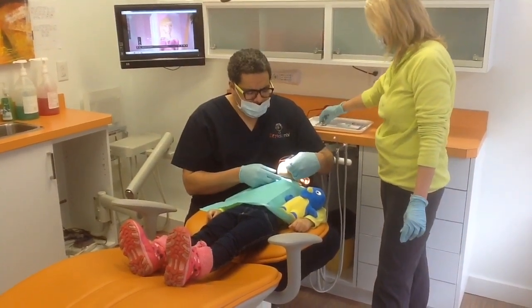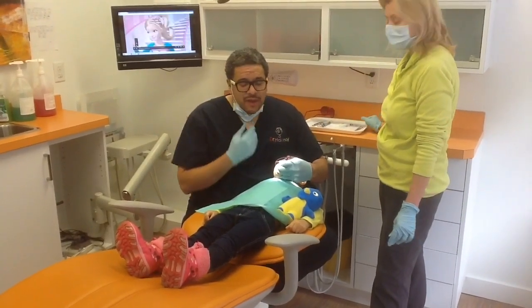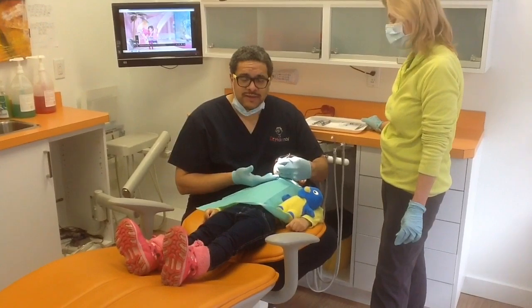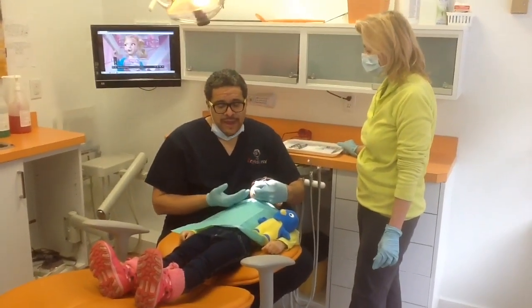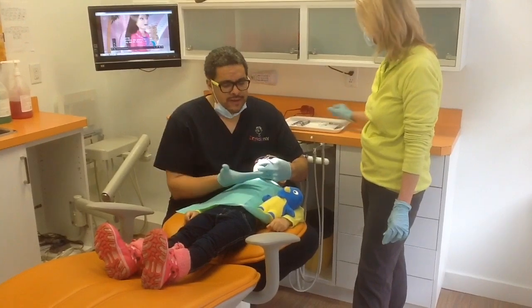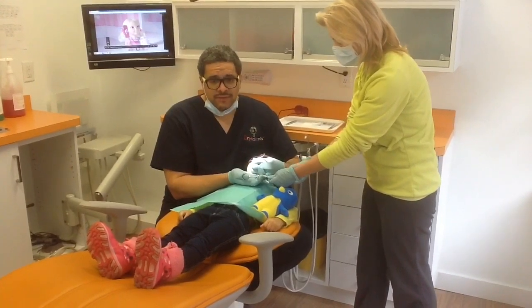When we're giving a side injection, you want to gently pull the cheek out. This does two things: it allows you to access what you're looking at, but also when the mirror is touching the gums, it gives the child a little bit of sensation. That's important because if you give them an injection and you're already touching the gums, if you do it gently, they may not know the difference. We're going to simulate this — we're not going to give an actual injection.